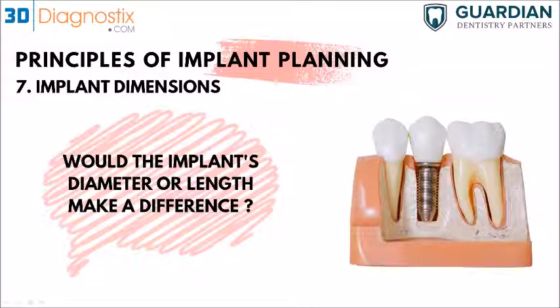So it depends whether you have the guided Versah kit. If you do, then we can actually provide you with a guide with a metal sleeve compatible with those components. So you can start with the pilot drill and then move along the diameter of the drills to densify the outline of the osteotomy as much as you can to make sure the implant is going to end up being stable. Or if you're planning on using those Versah drills to bump the sinus, for example, we also place the implants.